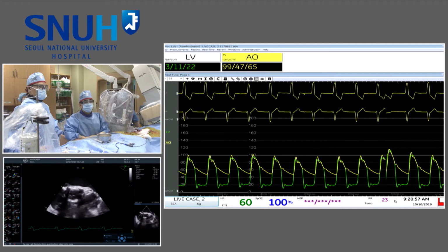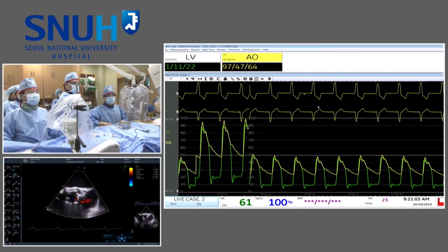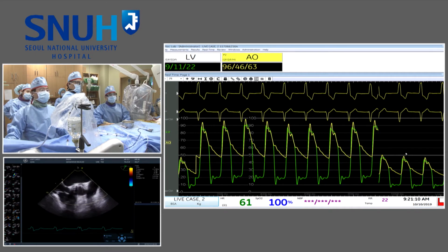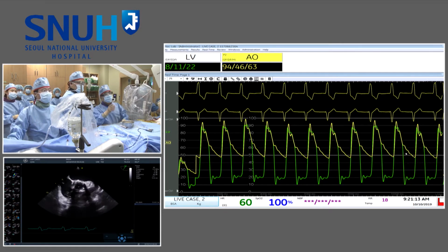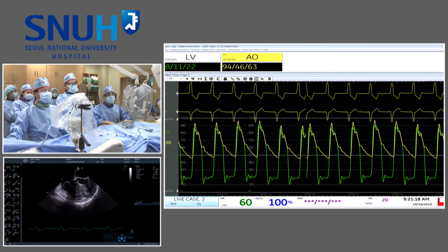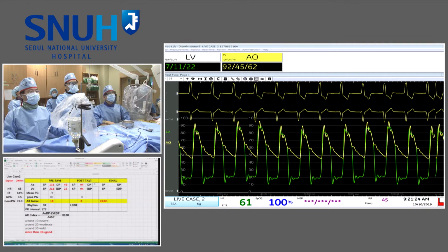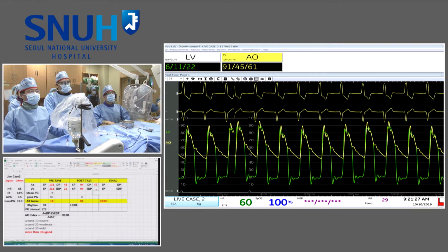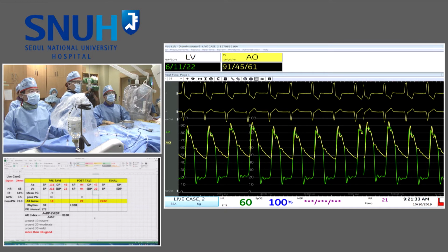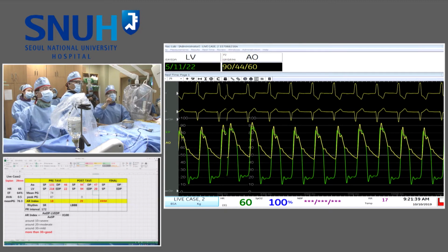Change the hemodynamics scale a little. So we can see the pulse pressure is narrow, suggesting no leakage. Very nice. Definitely. Just please calculate AR index. LVEDP 20, diastolic pressure about 45, systolic pressure about 85. I think they have a perfect systolic result. 85. Very good results, 84, 85.